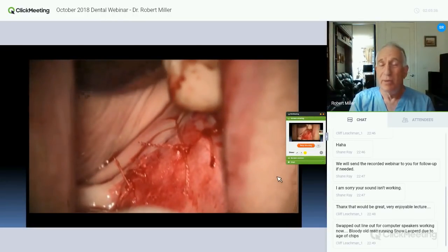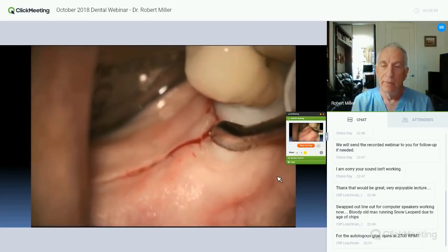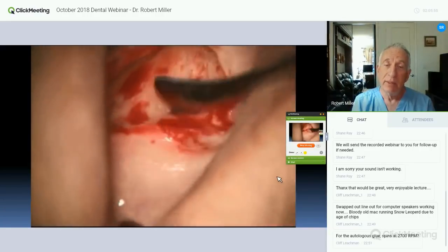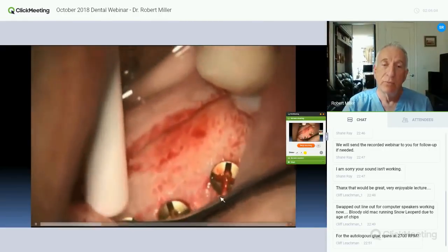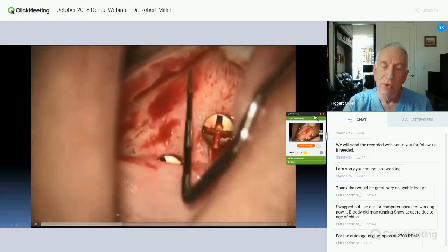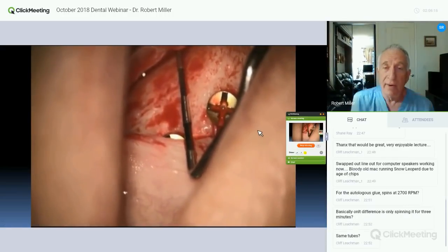Then we re-enter. I don't care whether you enter 4, 5, 6 months in these one-wall defects where there's a lot of bone to be reformed and only one wall to grow from. I like to wait about 6 months because these are pretty large grafts. When we reopen, we see something remarkable. The one thing you do not see here, you do not see particulate. This is 100% vital bone. In fact, there's a cortical bone layer here that's reformed. This right here is the original ridge from this line back to here. This is all grafted bone. This is a 12 millimeter wide grafted area.